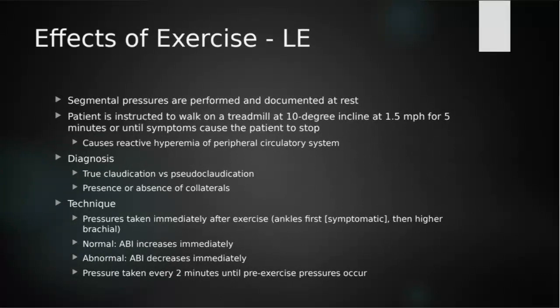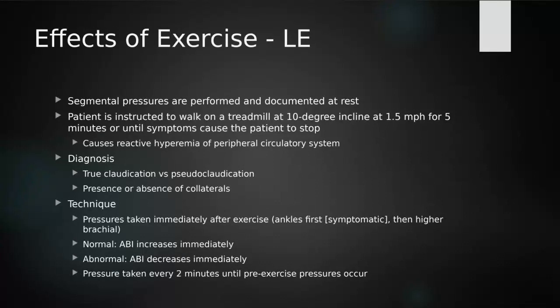Sometimes there is a need for us to have the patient exercising during this exam. So we will have our patient walk on a treadmill at a slight incline, 10 degree incline, at 1.5 miles per hour for 5 minutes or until the symptoms cause the patient to stop. So depending on what we're looking for, it's either 5 minutes or until our patient is like, oh my gosh, I need to stop right now.